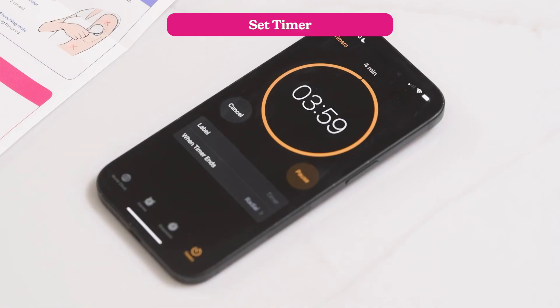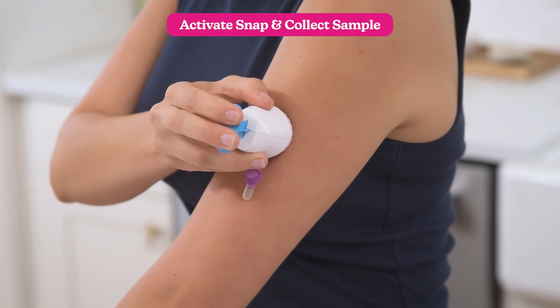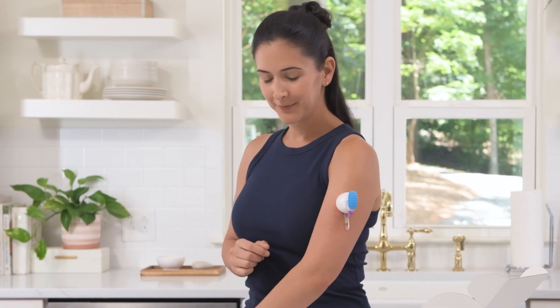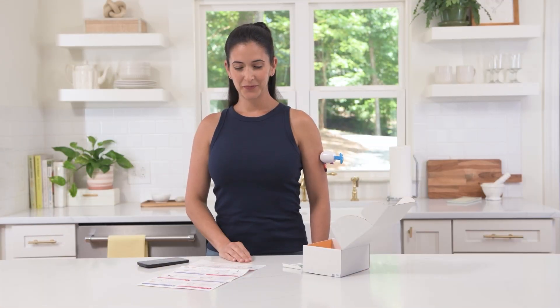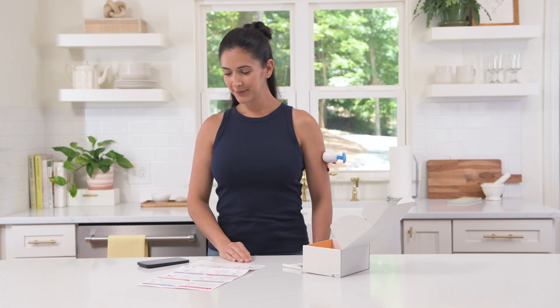Set a timer for four minutes, then press the blue plunger firmly in toward your arm. You'll hear a click, then immediately let go. The suction generated as the plunger releases is what draws your blood. Wait for the blood to reach between the dual fill lines, or wait after four minutes — it might happen fast.